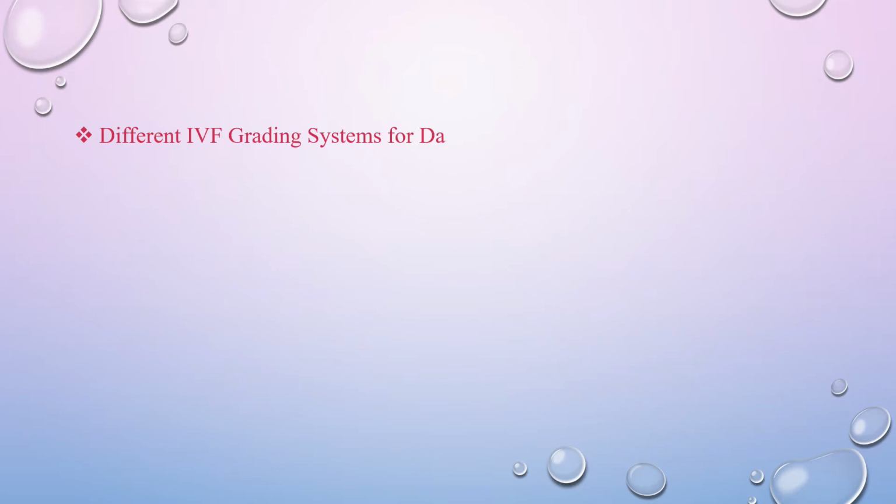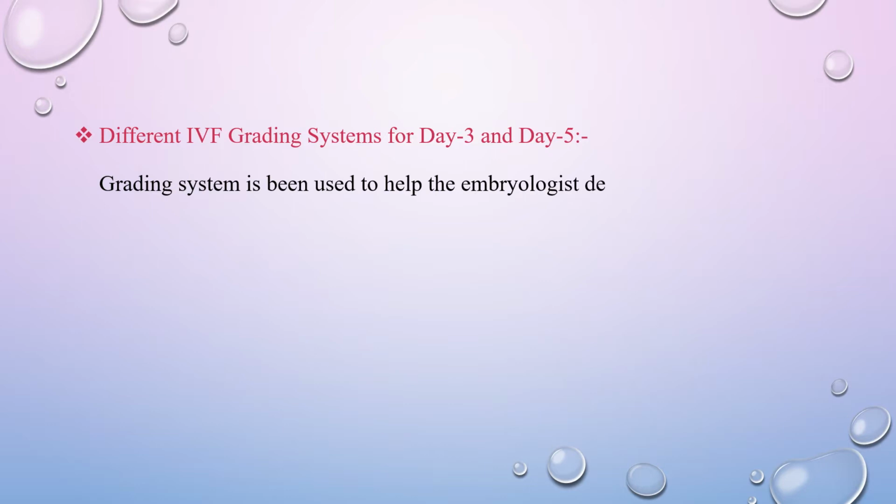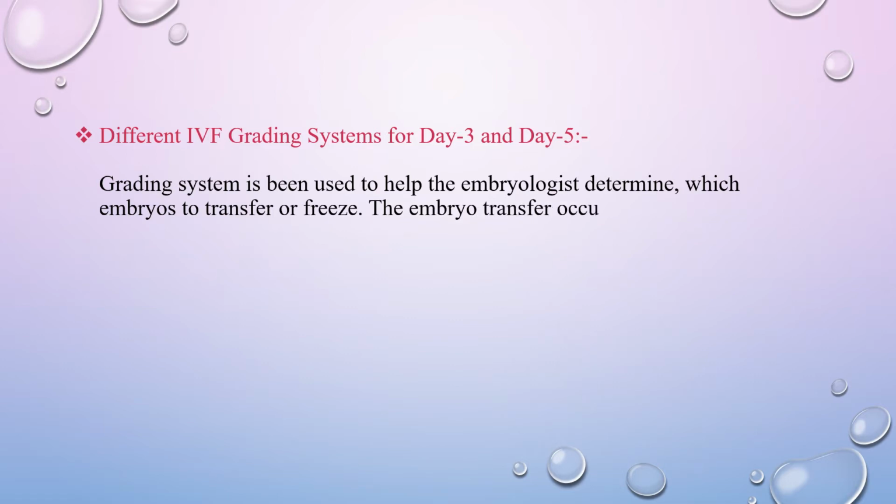Different IVF grading systems for day 3 and day 5 embryos. The grading system is used to help the embryologist determine which embryos to transfer or freeze. The embryo transfer occurs either 3 days or 5 days after a retrieval.